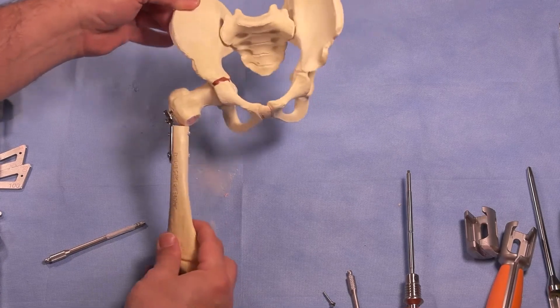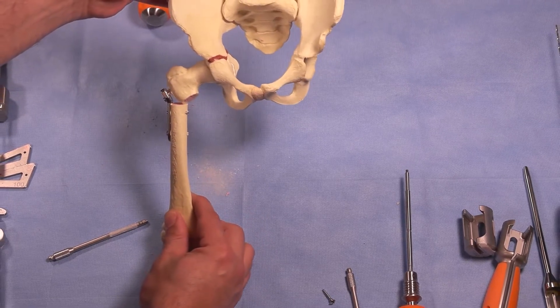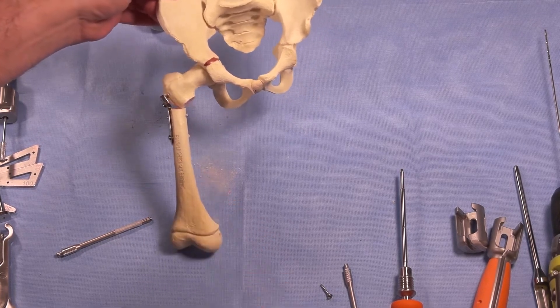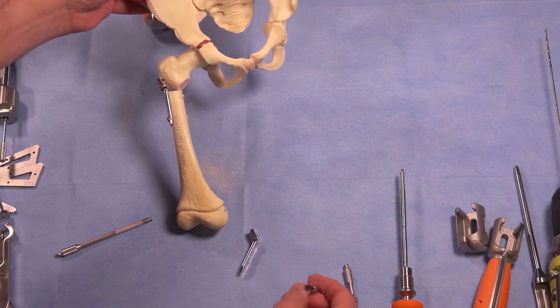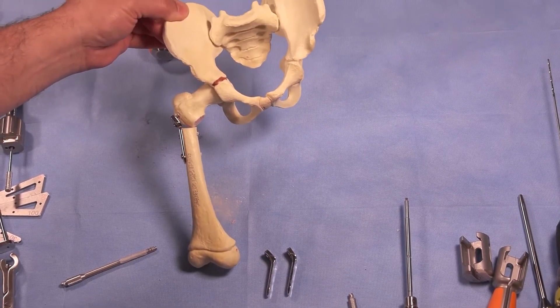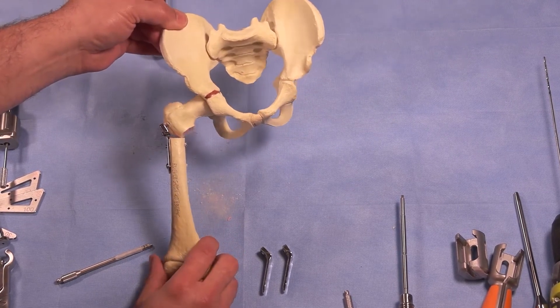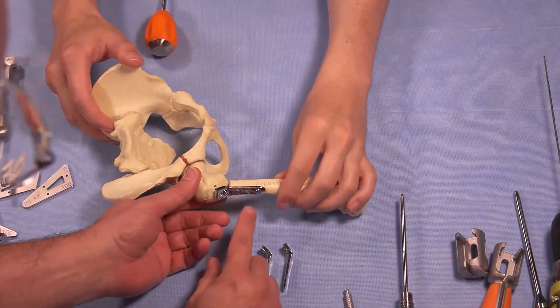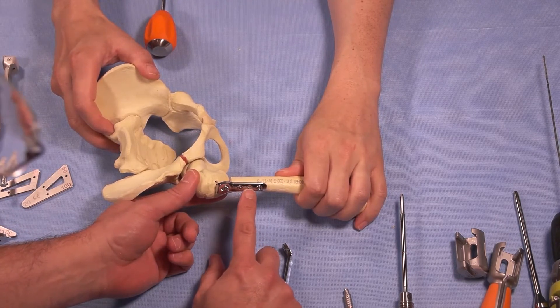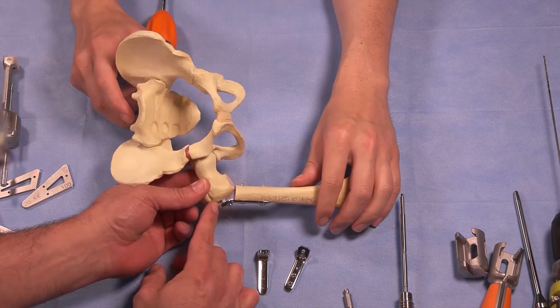You would also put another screw here — this is just saving time for the model demonstration. We have now achieved a neck shaft angle of approximately 120 to 130 degrees. You can choose different angulations depending on what plate you attach, giving you the availability of variation and flexibility during surgery. That's the beauty of the modular blade plate system. After placing the locking screw, you add an additional screw — locking or non-locking per your preference — and finalize the fixation. There are about five millimeters still left to impact.